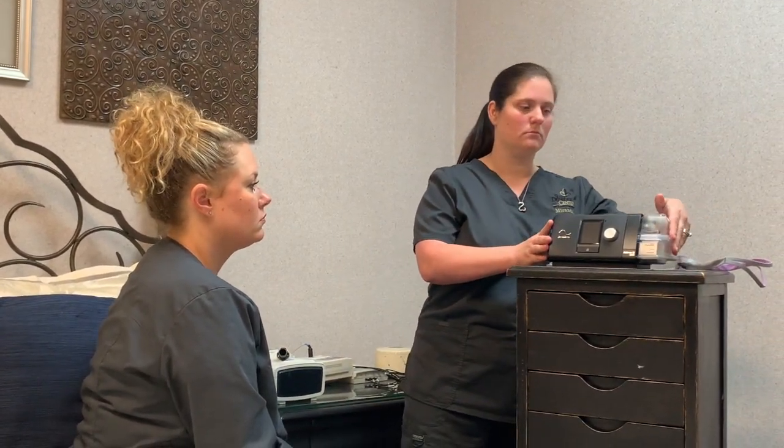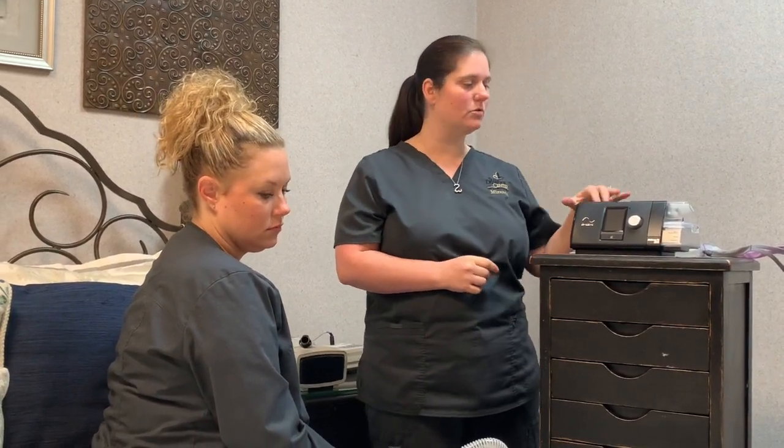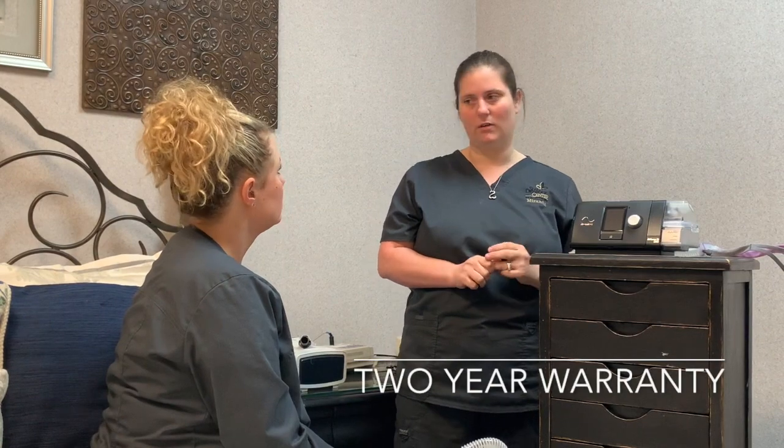You have a two-year warranty on this machine. If anything happens to it between now and then, just bring it back in to us, let us look at it, and we'll start the process of giving you another one. Do you have any questions? Not yet.